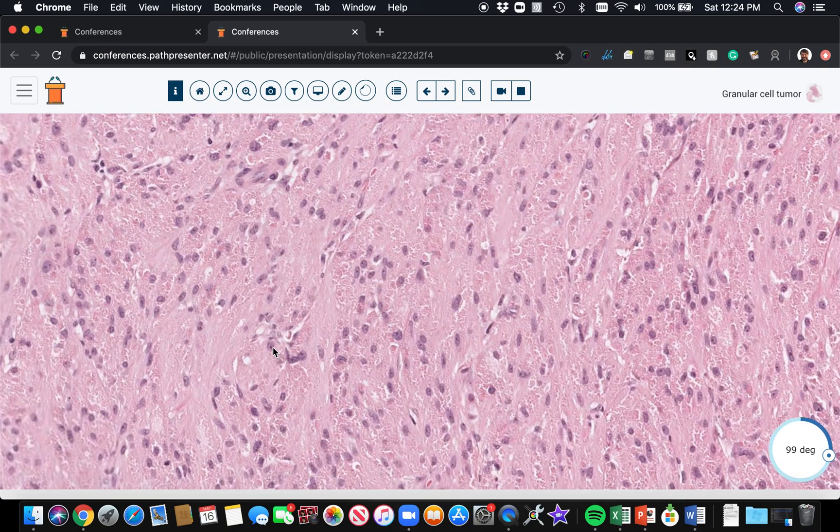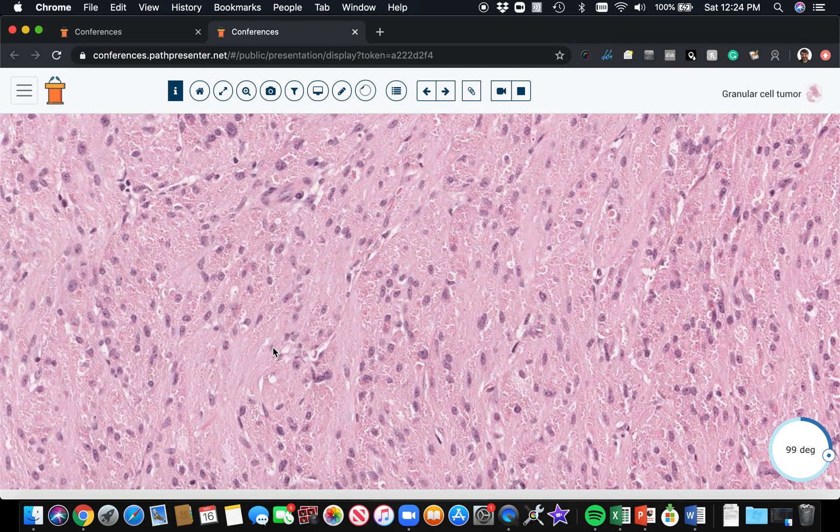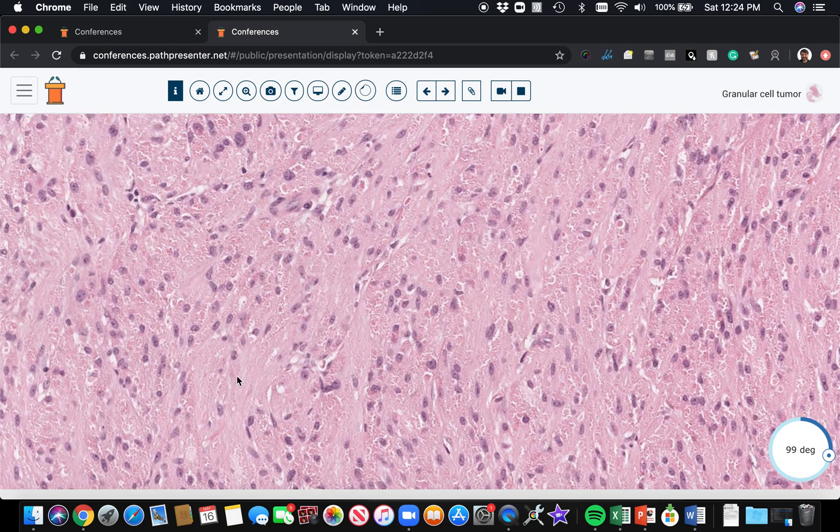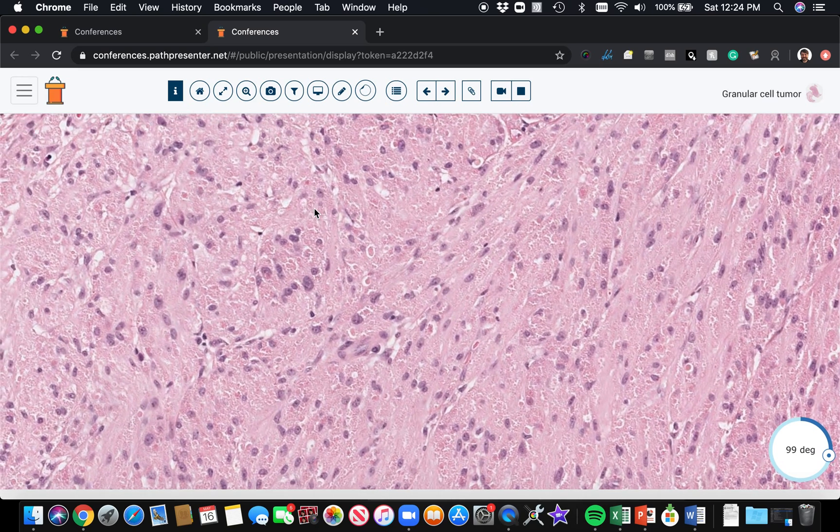In all honesty, most of the time these are diagnosable by just H&E. If you really need something, an S100 will easily solve the problem for you. So granular cell tumor.